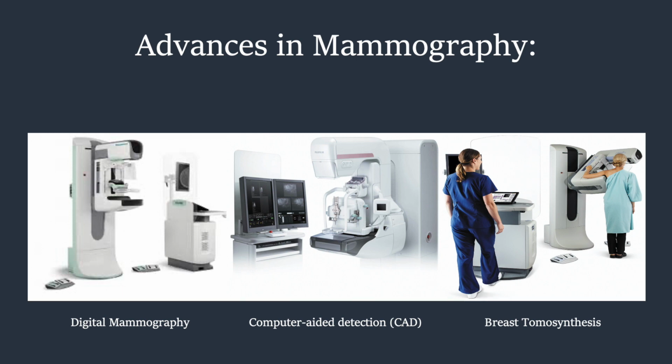We also have CAD. The system searches digitized mammographic images for abnormal areas of density, mass, or calcification that may indicate the presence of cancer. The CAD system highlights these areas in the images, alerting the radiologist to carefully assess the area.